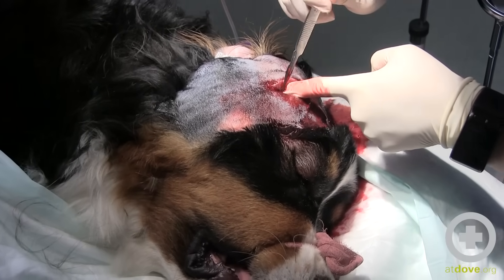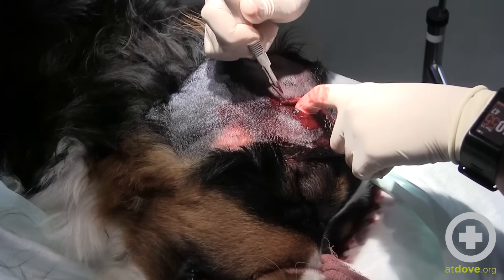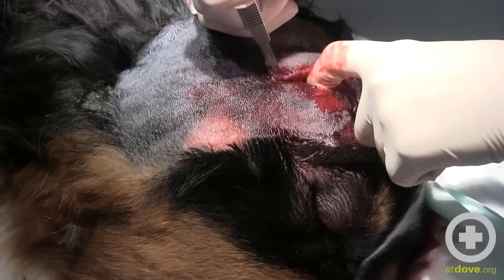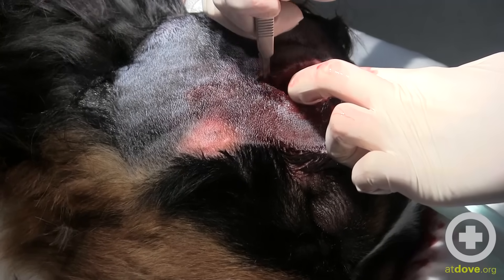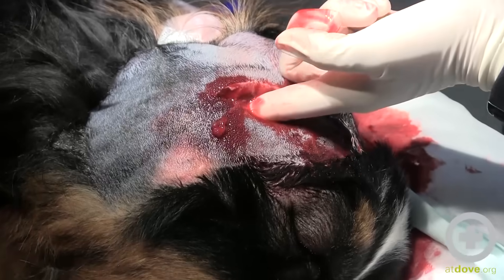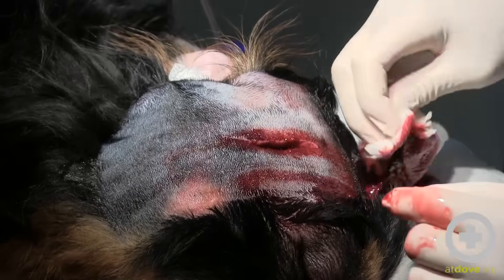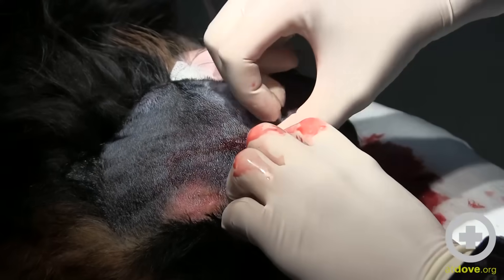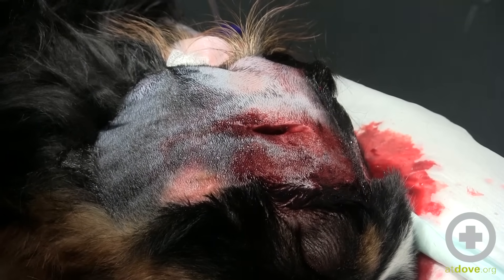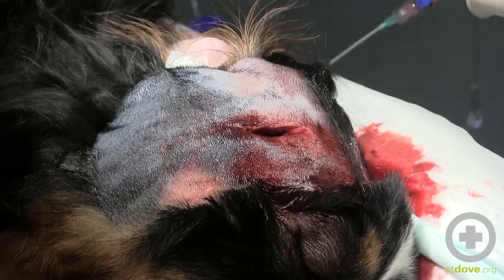Just trying to create some better visualization into the pocket and also create enough space, because I'm anticipating packing this with gauze in a wet-to-dry format. This is a big hole to leave an owner to just manage as an open wound, and the gauze packing also allows us to debride the tissue over a few days to promote healing from the inside out.